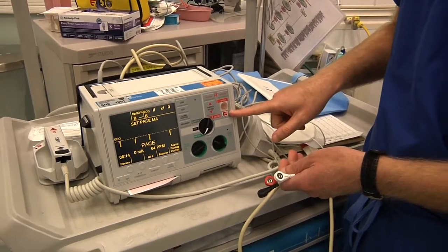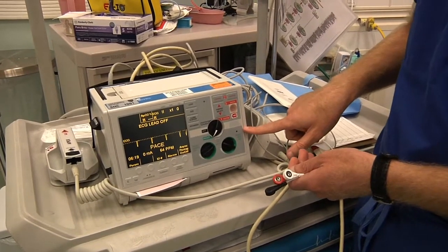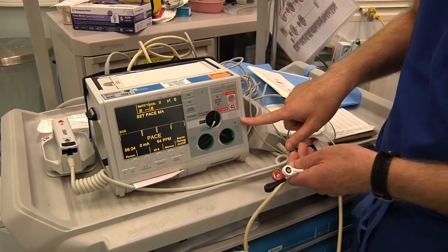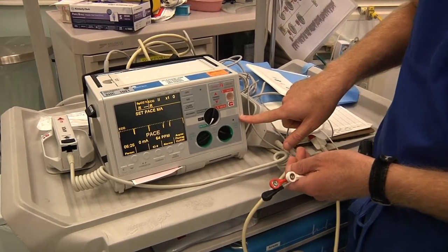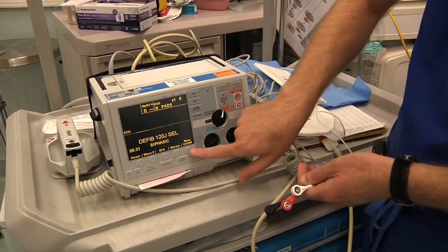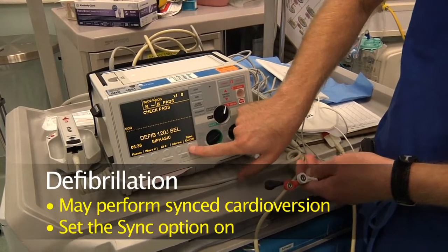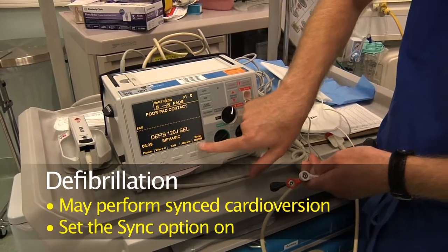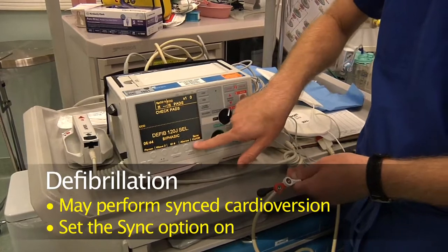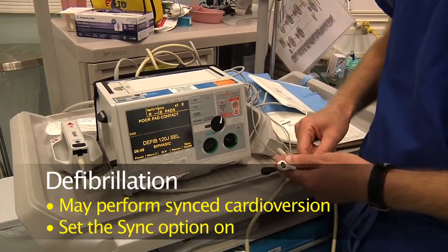One last thing on the defibrillator is that there is the ability to sync or not sync, and on this defibrillator, let me go back to here, it's here, sync on or off. So if you're going to do a cardioversion, not a defibrillation, but a cardioversion, you would put the sync on here. So that's important to remember. And almost all defibrillators, after your first synced shock, go to desynced, meaning the sync goes off. So you always have to resync it for each synced cardioversion.